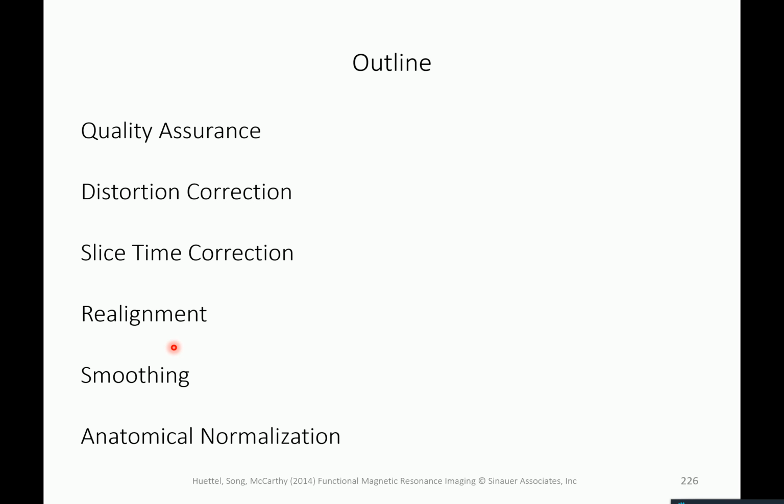So the important thing is that you do everything script-based so that it can really be tracked, and that once you think you have found the result of your study, you protect it a little bit, in the sense that if you change the preprocessing slightly, not everything goes away. Your highly sought-after statistically significant result should not vanish once you make the smoothing 0.5 millimeter less, because then it was strongly determined by your specific preprocessing routine.